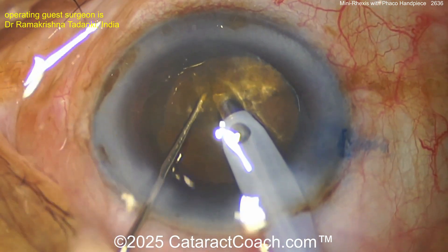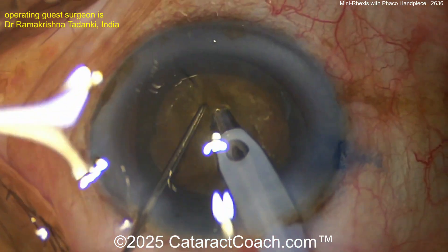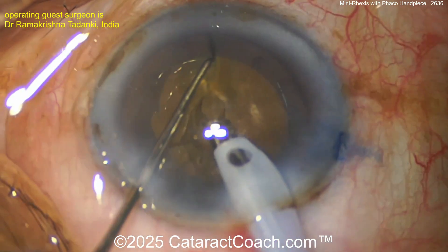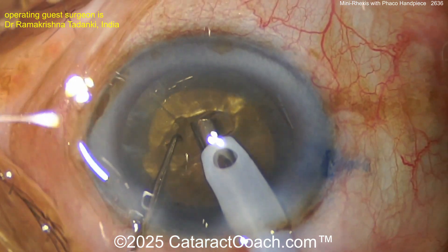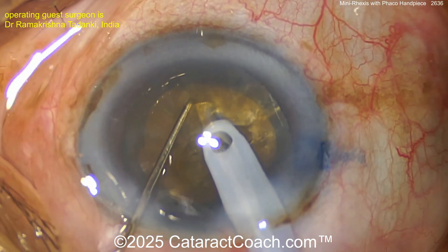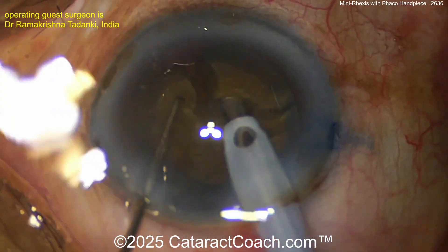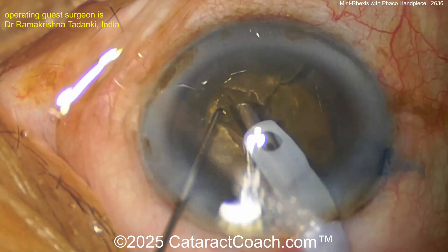A little pit — there it is. And here's a horizontal chop with a sharp-looking chopper. These cataracts tend to be brunescent and fibrous, making it hard to propagate the chop all the way through. There can be a posterior plate on the back of the nucleus.